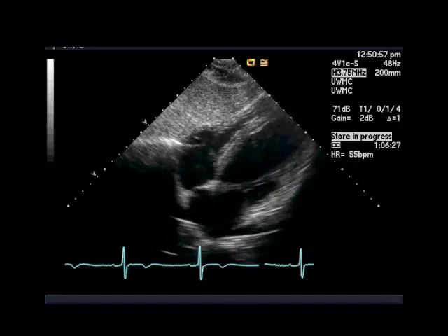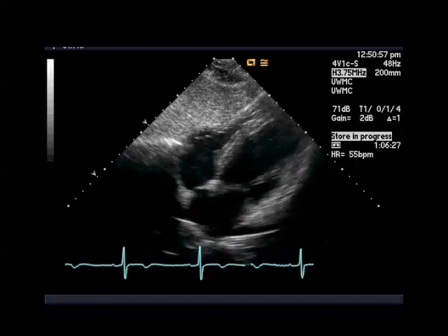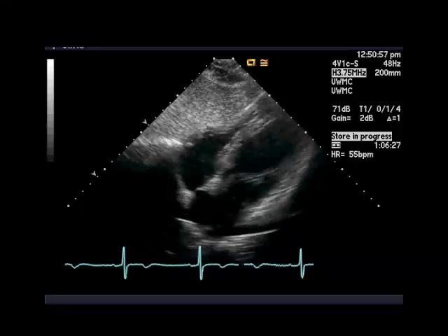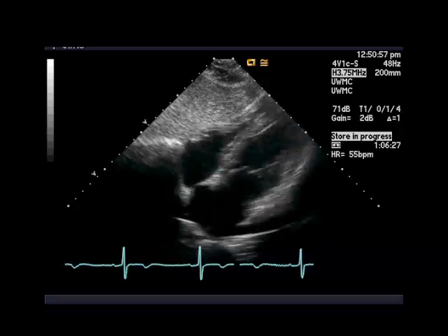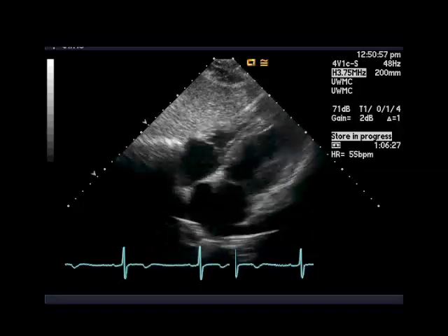The liver is seen closest to the transducer, with the right and left ventricles, right and left atrium, and both atrioventricular valves well seen. This view is particularly useful for evaluation of right ventricular size and function, and for examination of the atrial septum. Subcostal views also may be helpful when other acoustic windows are suboptimal.